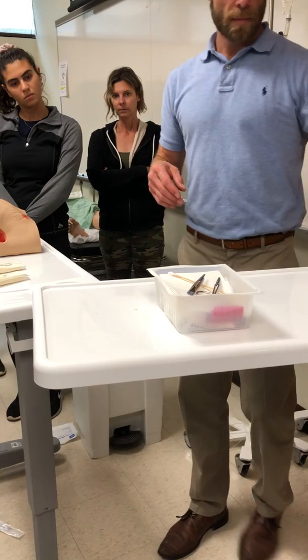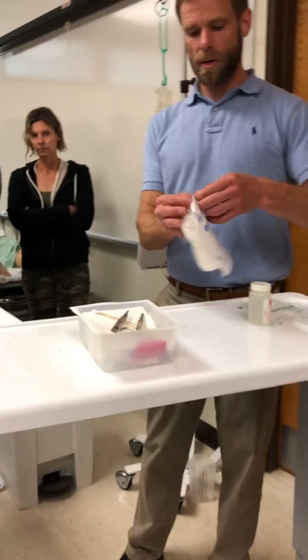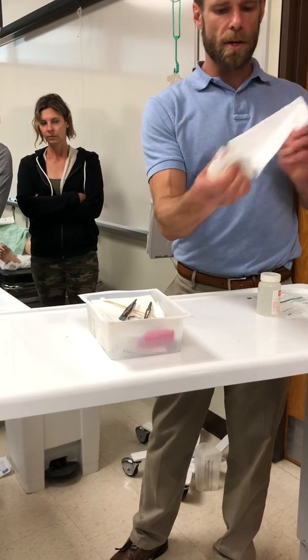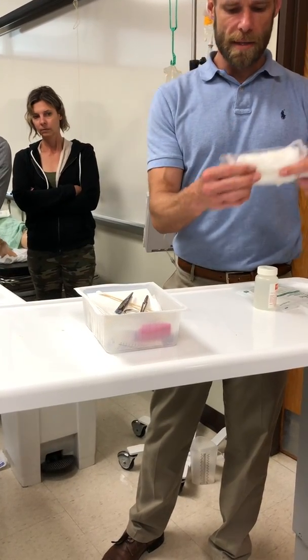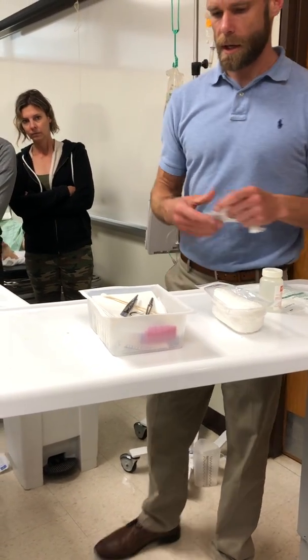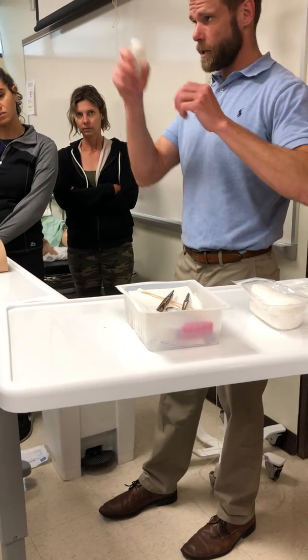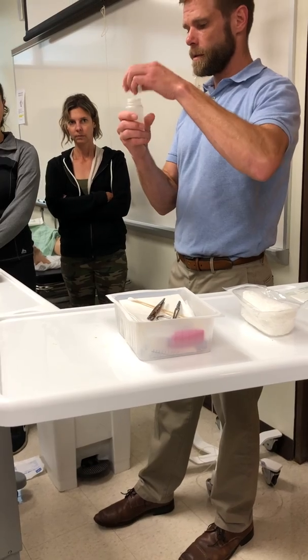I just miss. Okay, and I'm going to go ahead and open this up, even though I don't need to use it because there's gauze in there, but I want to show you what you do if you're at a hospital where you don't have this kit. Ready to check the color, expiration, integrity?